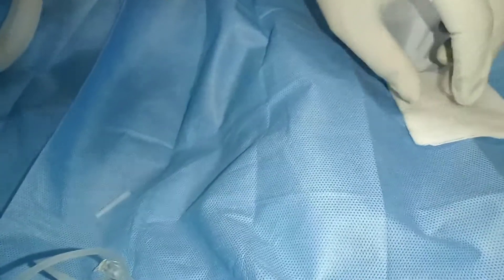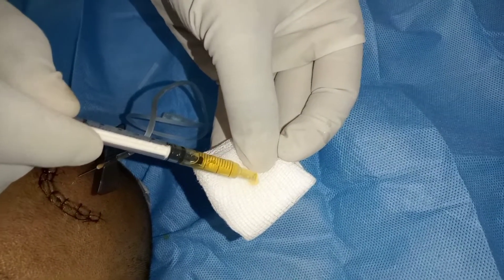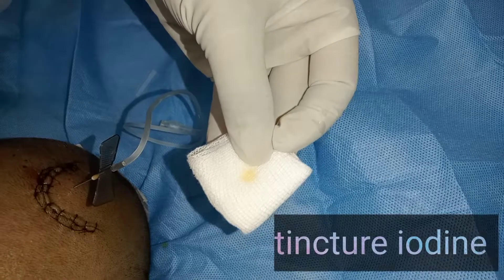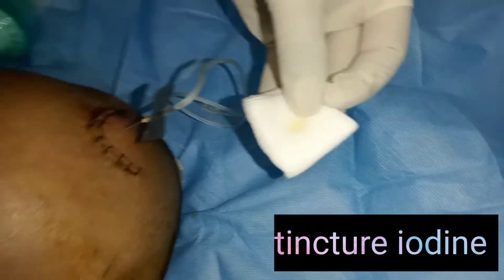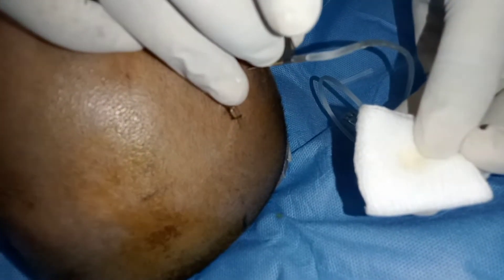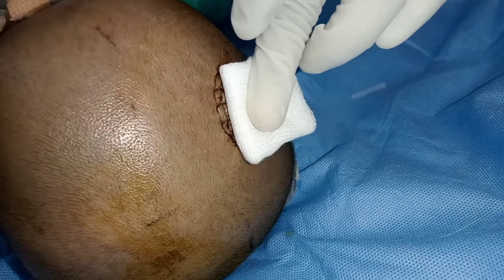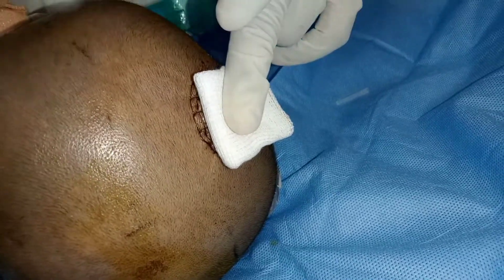Once the desired amount of CSF is drained, it is time to take out the needle. A small amount of tincture iodine is added onto a sterile gauze piece. The needle is taken out and the puncture site is covered with the tincture iodine swab.